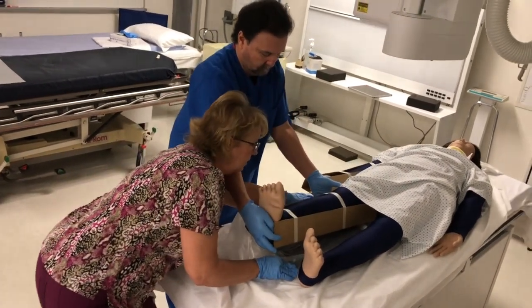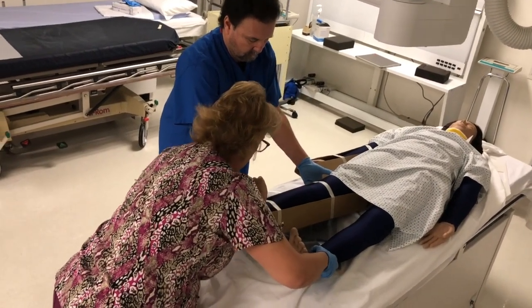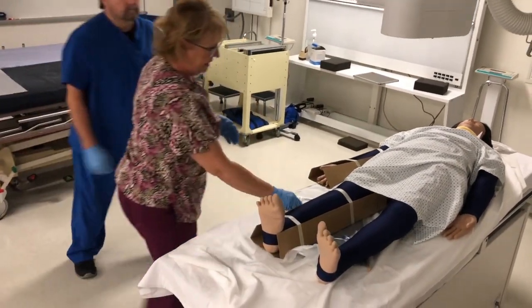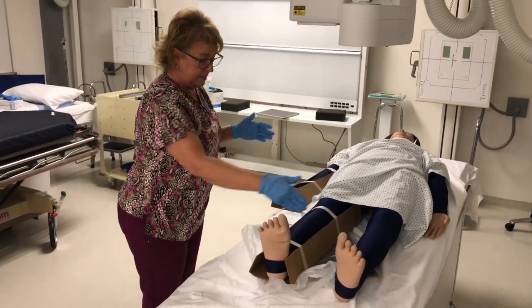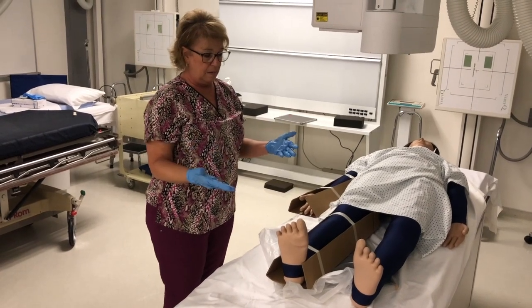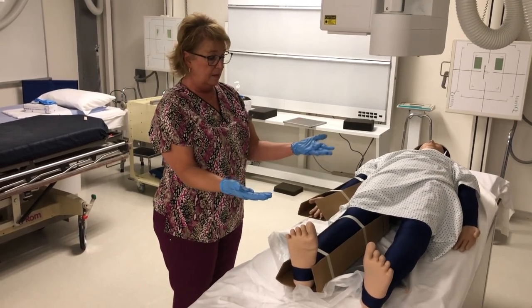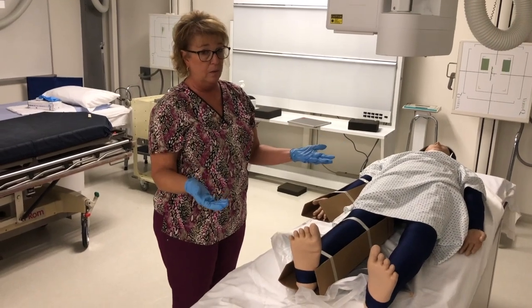And if I had a long patient, I might need to angle this diagonally to fit both joints. Okay. Place my marker, shielding, again, pull the tube over, centered. You guys, we've been through extremity work. This is really just demonstrating the need for you actually supporting the limb, and then, you know, also if the patient was conscious, letting them know what you're going to be doing.